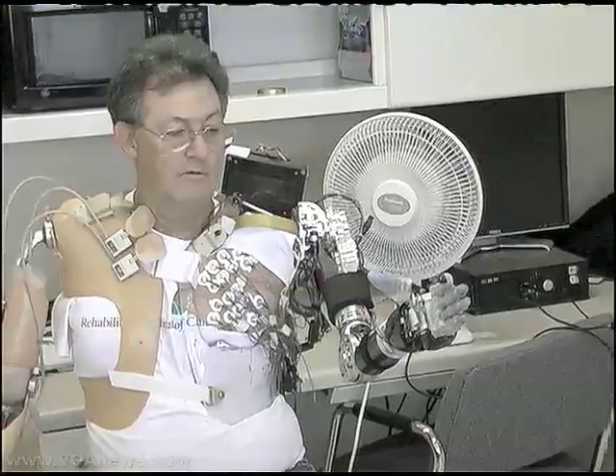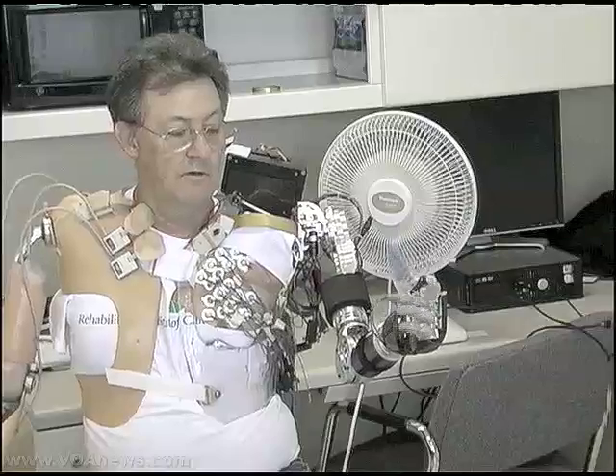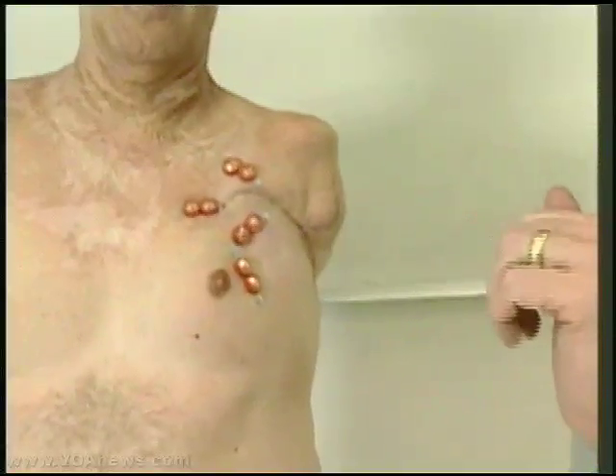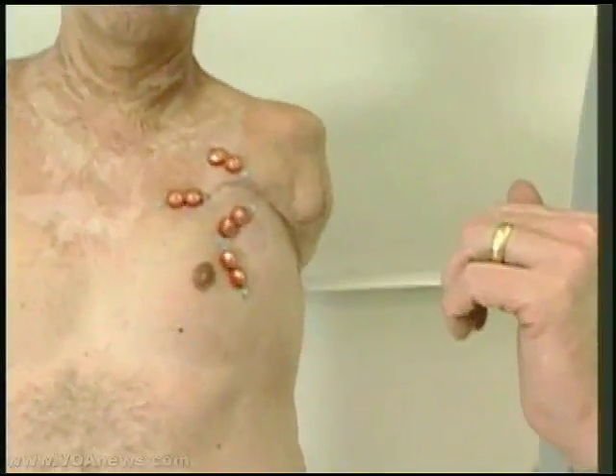When the patient thinks 'closed hand,' for example, a little piece of muscle on their biceps or on their chest contracts. We can use that signal to tell them to have their prosthetic hand closed. The relocated nerves produce the same feeling they did in their original locations.